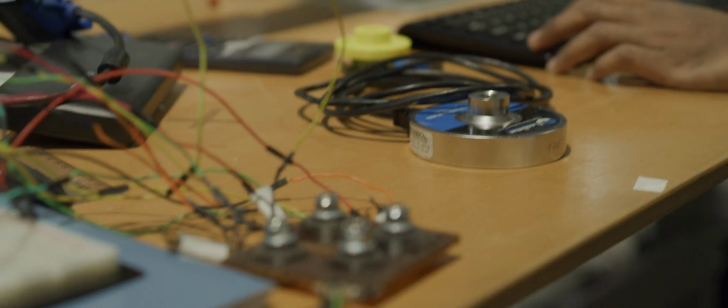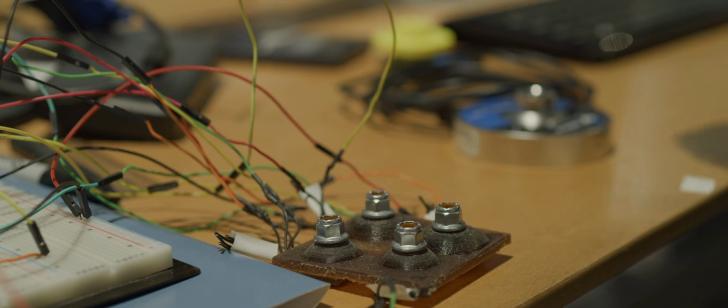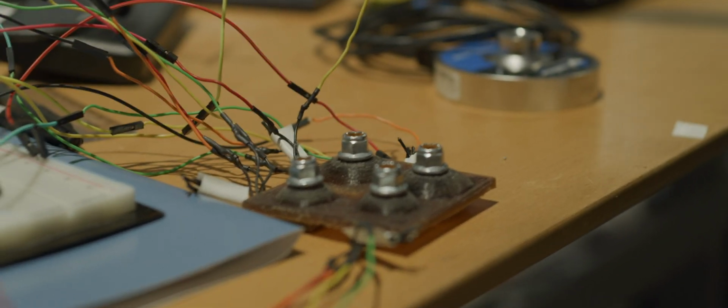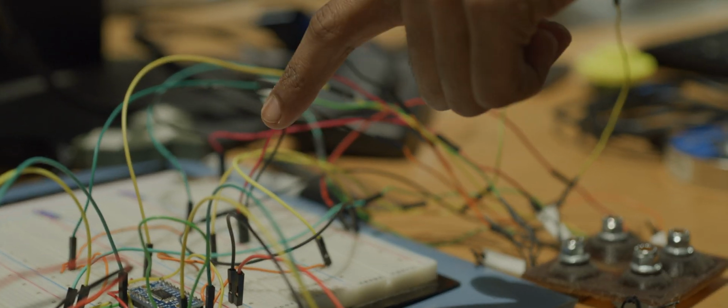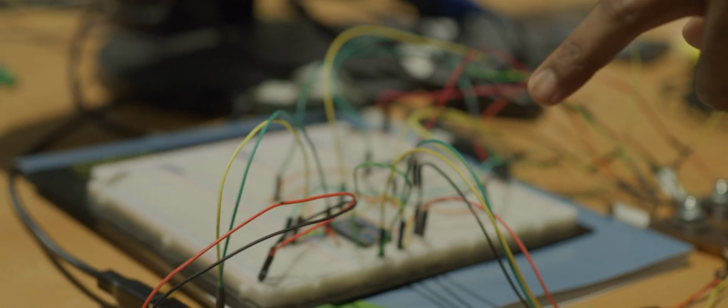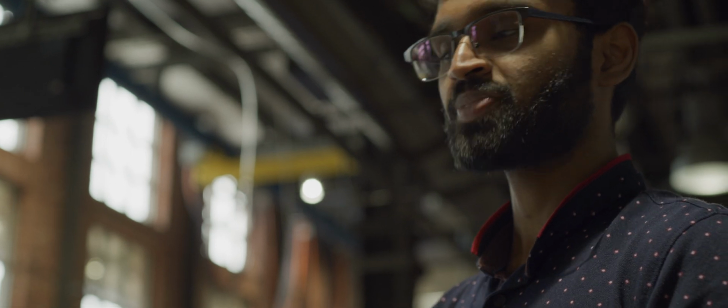So what are these? So these are the pressure sensors that are going into the foot. And I've connected all the pressure sensors to a multiplexer and from the multiplexer, I'm going to connect it to the Arduino. So once I start loading the pressure sensors, I should be able to see the reading of the pressure sensors in terms of force.